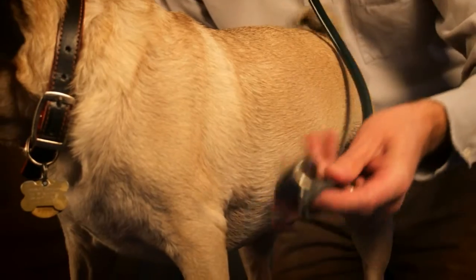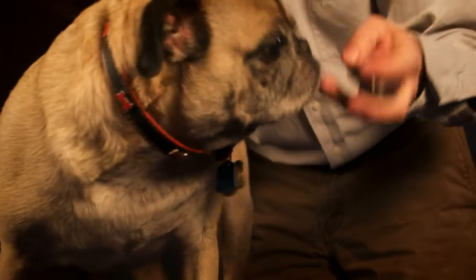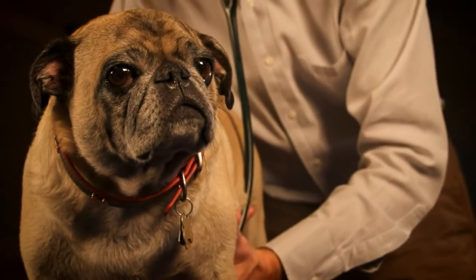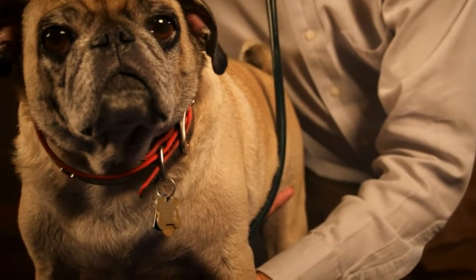The same technique should be performed with the bell of the stethoscope. So on my stethoscope, we flip the stethoscope over and repeat the procedure with the bell. The bell is better for detection of gallop sounds, lower frequency sounds.